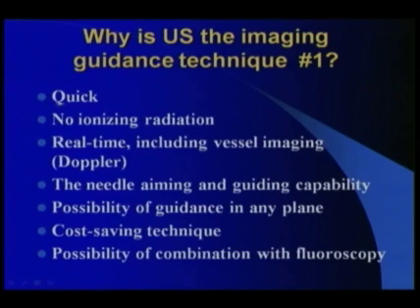First of all, it's very quick. It's not connected with ionizing radiation. It's a real-time technique, and at the same time we can not only have the B-mode image, but see the vessels in real time. We can aim and guide the needle in real time.